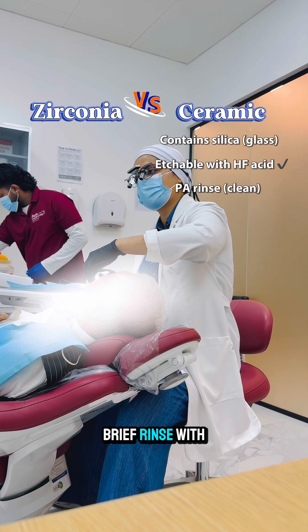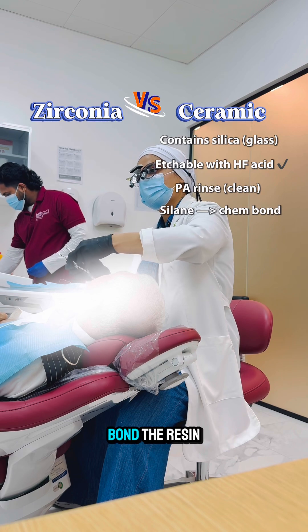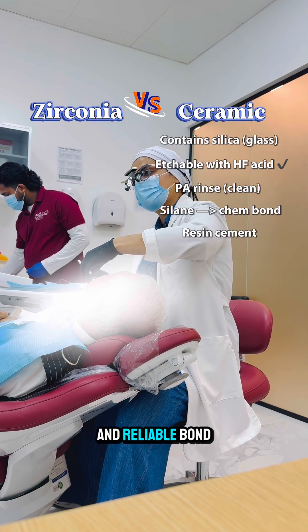After etching, a brief rinse with phosphoric acid removes any leftover salts or debris, and a silane primer is applied to chemically bond the resin to the ceramic, giving a strong and reliable bond.